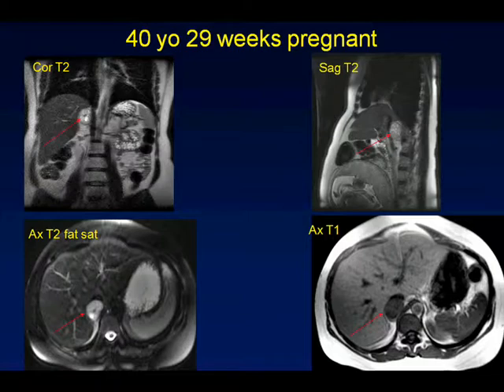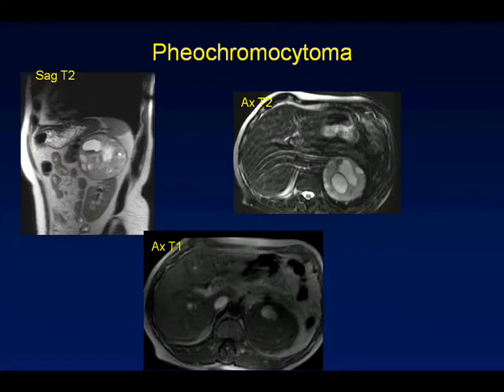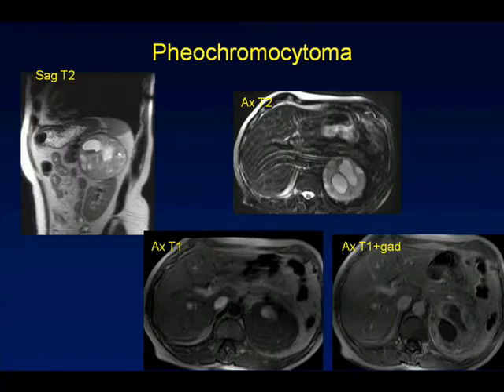So history is a clue because this is another case of a pheo, and the differential could be here of a complex metastasis that has solid and cystic components, as shown here. And even a primary adrenal cortical carcinoma is also in the differential. So in terms of using MRI to differentiate, it can be sometimes non-specific. And certainly for pheo, you really need the history as the clue.